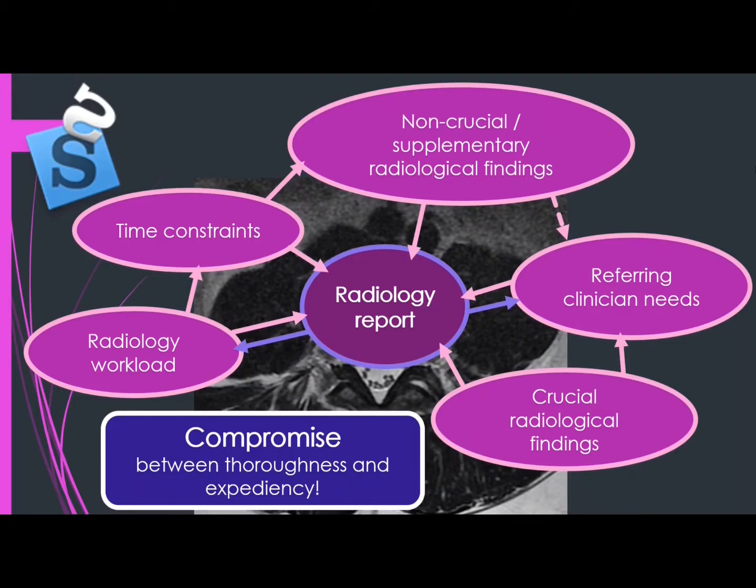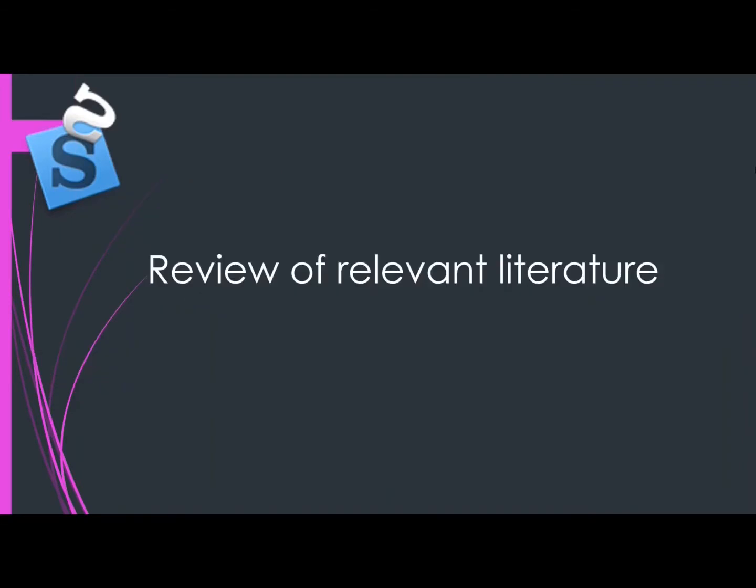However, the radiological report needs to contain crucial information and also as much additional information as possible to make the clinician's life easier. However, that is not necessarily always possible due to time constraints and the increasingly climbing radiological workload. So a compromise in all situations must be achieved, in which cases sometimes we must sacrifice details for expediency. The biggest findings do get reported, but smaller ones might get overlooked.